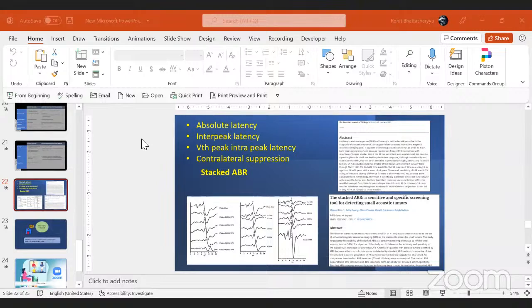May I ask one more question regarding this one? Yes, sir. Can you hear me? Yes, sir. We can hear you. Normally, speech discrimination score is not generally advised by ENTs. So, in what audiological findings would you suggest that a speech discrimination test should be done?